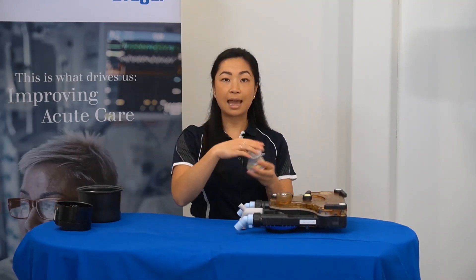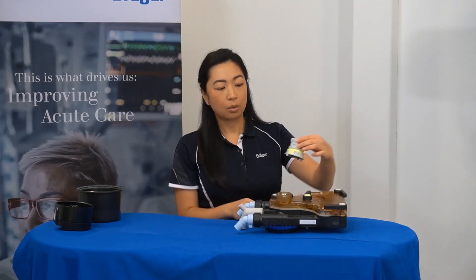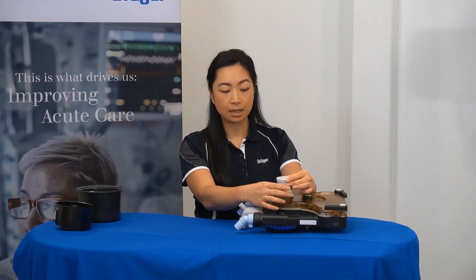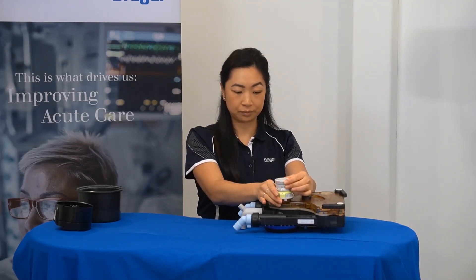Then, the APL valve can be placed on the top of the cover. With one hand, aim the dot to the front of the breathing system, and with the second hand, correctly thread the base of the APL valve. Once again, just so it's finger tight.